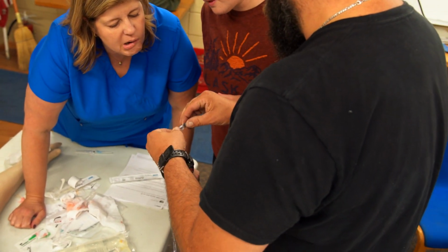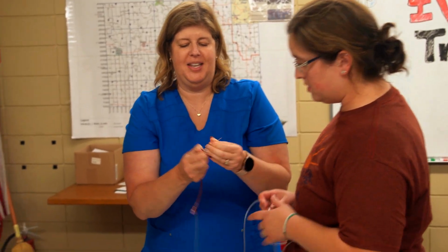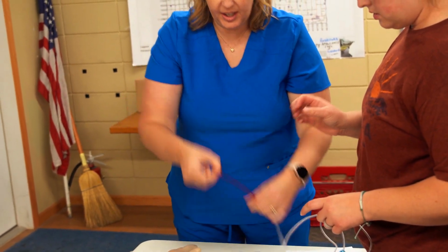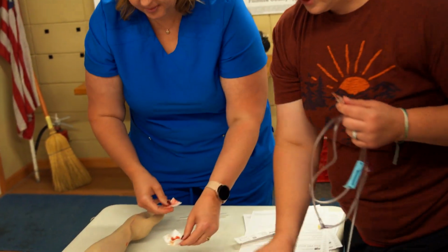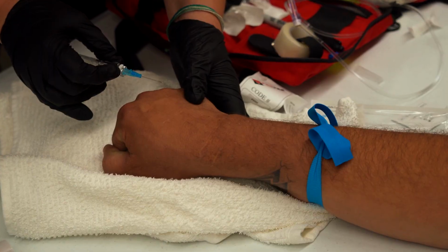So if you look and go, oh, I can't get that, it looks too squiggly. Well, I'll throw another slight twist at you. Occasionally, especially little old ladies with fragile veins, sometimes not using a tourniquet, because we put too much pressure in there, but that's a unique situation.